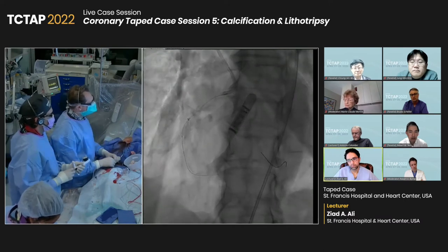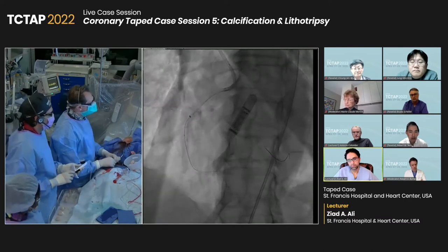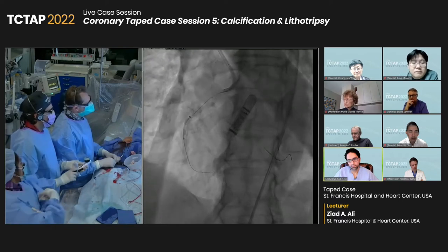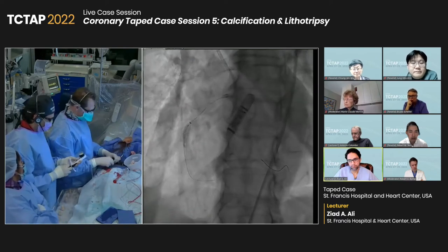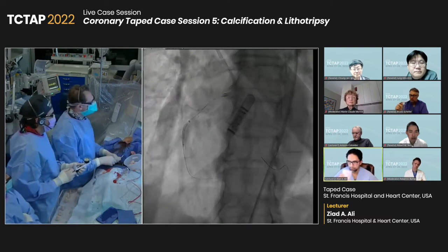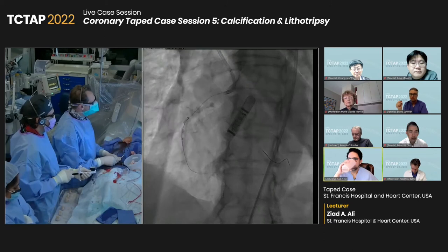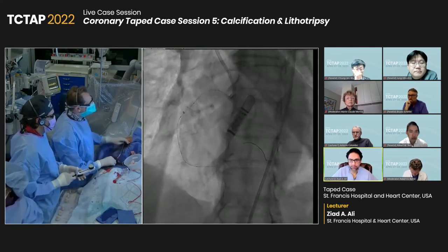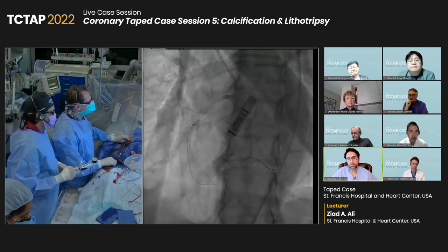All right, go up again. Going a little bit more. I think that's ballooning the guideliner still. Okay, good. Again, I'm not going too high here because all I need is a little bit of traction for Alan to be able to get around. All right, go down. Okay. No, it doesn't go around here. Okay. Watch your guide.